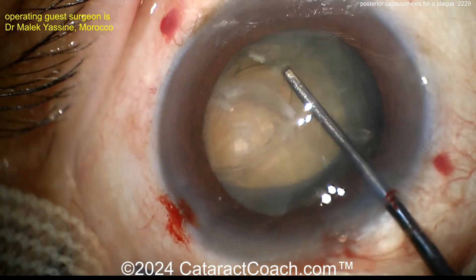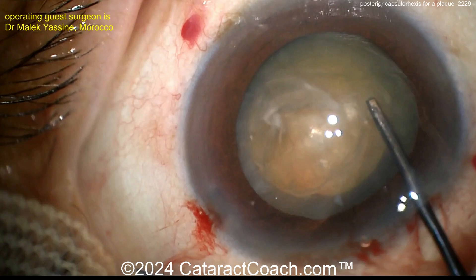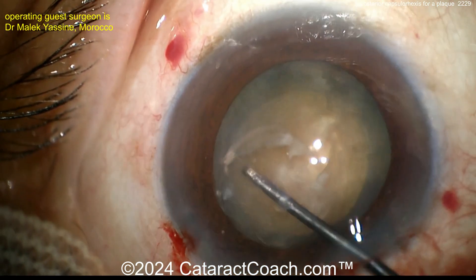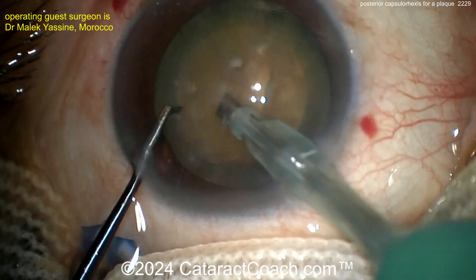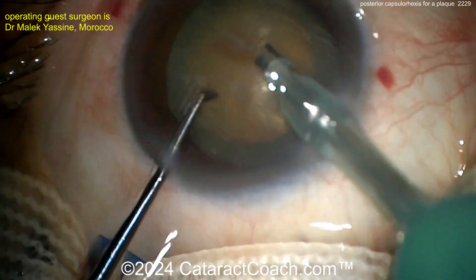Does it rotate? It's looking like it's getting there. There it is — there's the rotation. So now it's rotated pretty nicely. Going in with the FACO probe and the chopper, probably a nice chop technique. Let's see what we've got here.